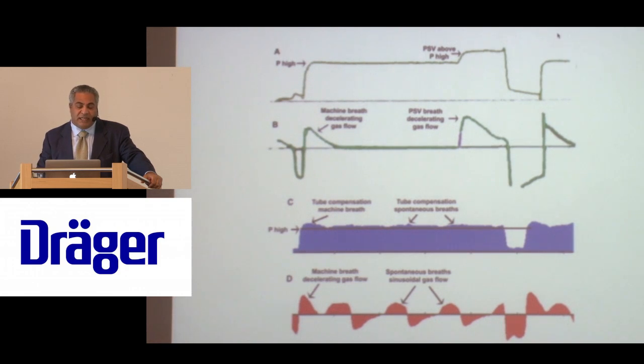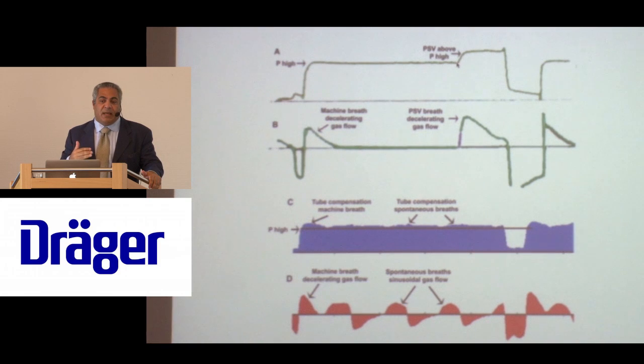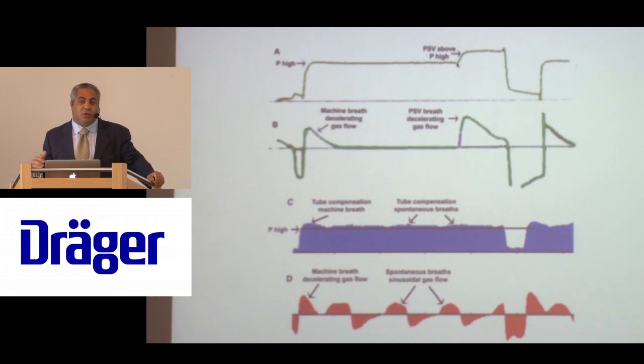And perhaps more dangerous would be the idea that what we want to do is set a top pressure. We don't want to exceed that pressure. So whenever you set a P high, which is a CPAP level, you really don't want pressure above that, because what's going on is that as the lung volume increases, the patient's diaphragm becomes in a position where they cannot generate any volume change. So if you happen to set it too high, you have that natural sort of safety, if you will.